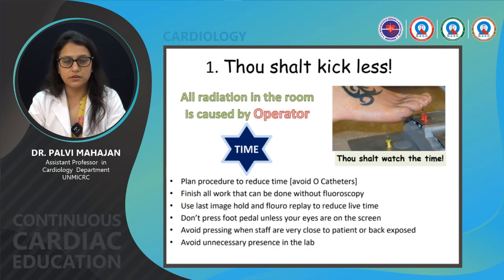Don't press the foot paddle unnecessarily unless your eyes are on the screen. Avoid pressing when the staff is very close to the patient or back exposed. Avoid unnecessary presence in the lab.